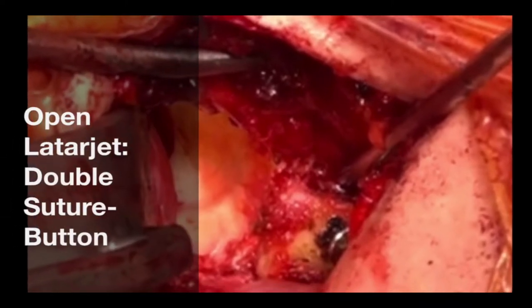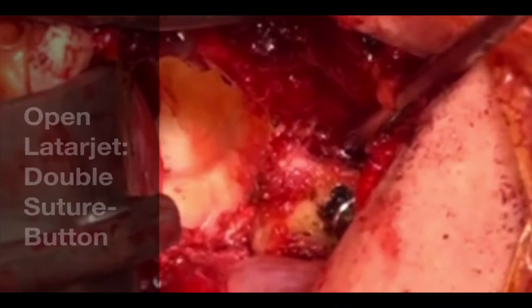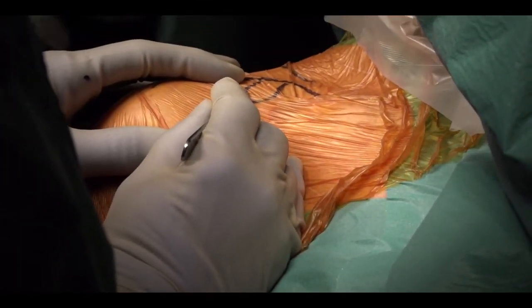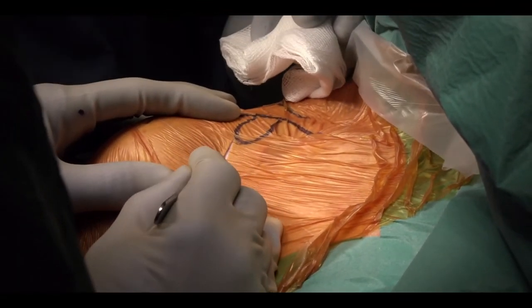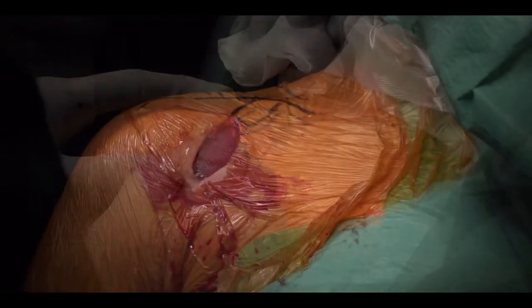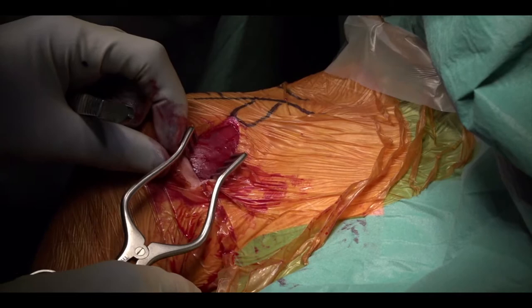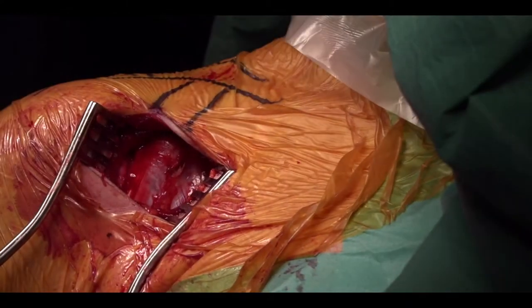Open Latarjet using double suture button fixation. The patient is positioned in the half beach chair and a vertical incision is made from the tip of the coracoid downwards 8cm. The deltopectoral groove is then opened up and the conjoint tendon and coracoid exposed.